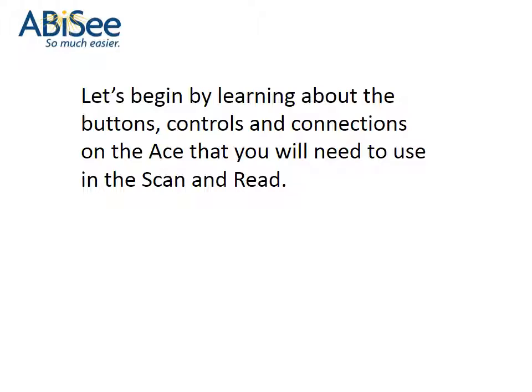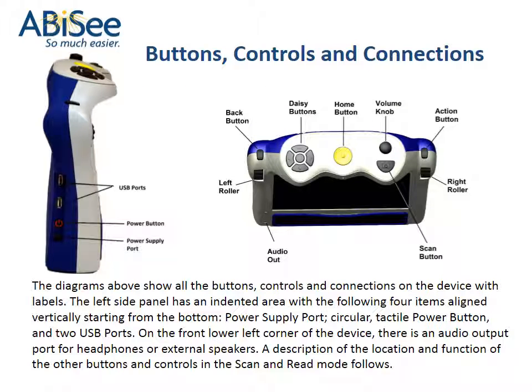Let's begin by learning about the buttons, controls and connections on the Ace that you will need to use in the Scan and Read. Buttons, controls and connections. The diagrams above show all the buttons, controls and connections on the device with labels.